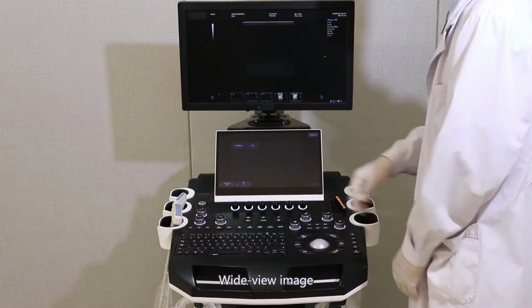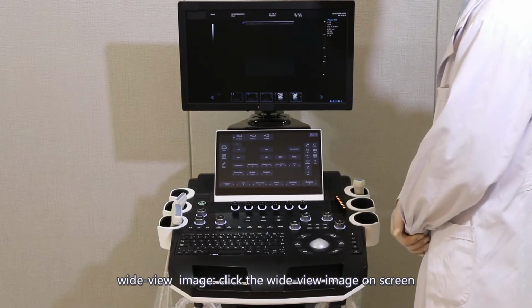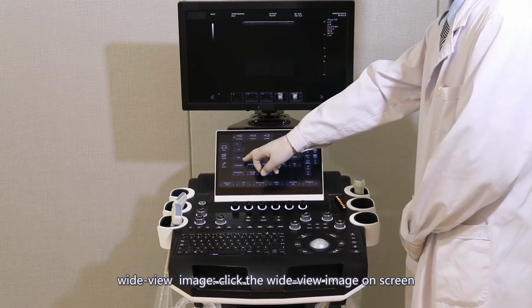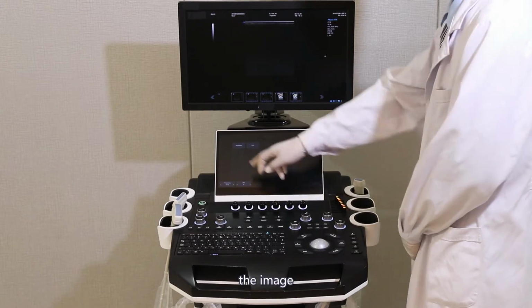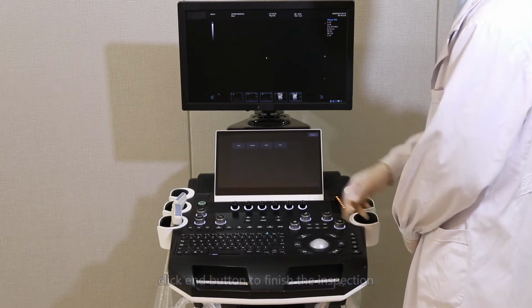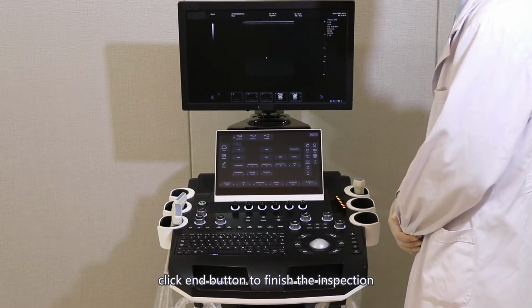Wide view image. Click the wide view image on the touch screen to collect the image. After the operation is over, click the End button to finish the inspection.